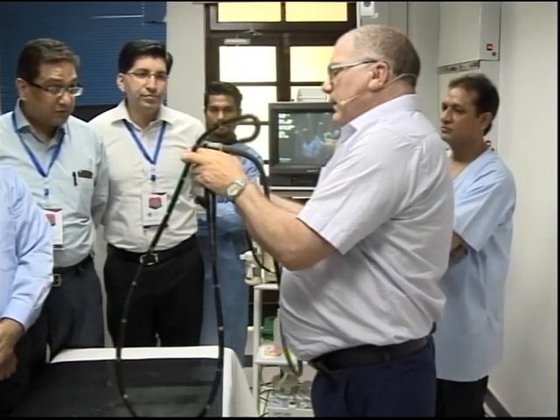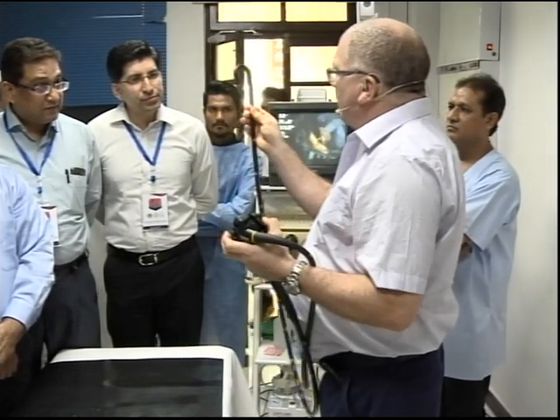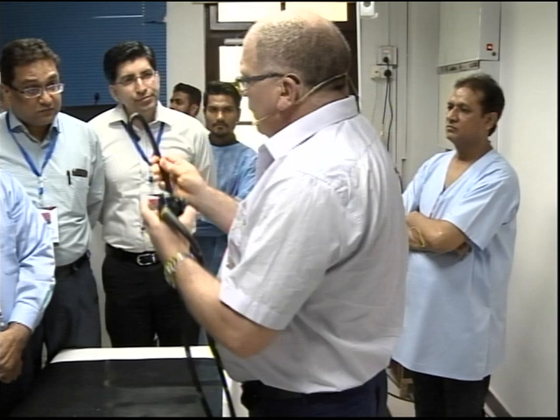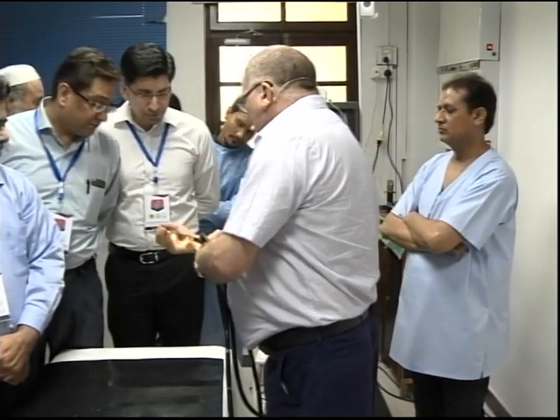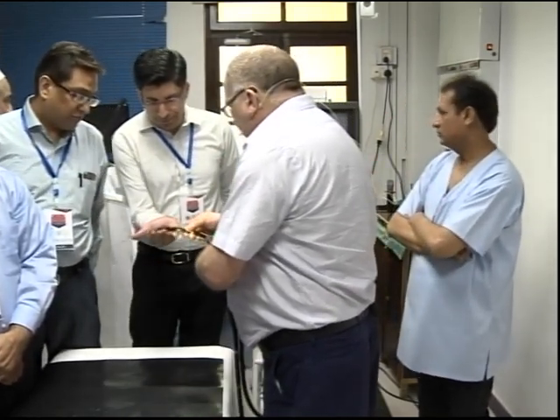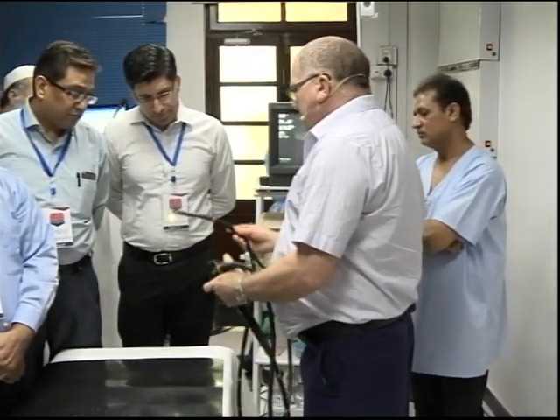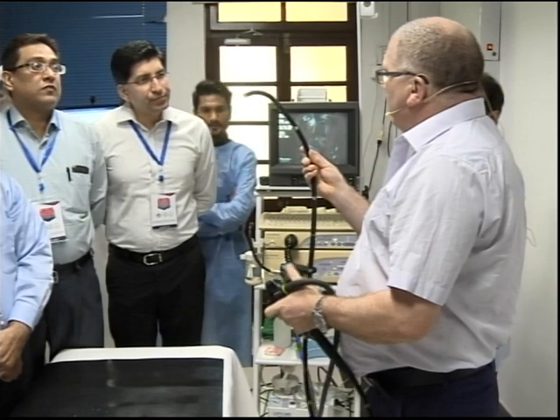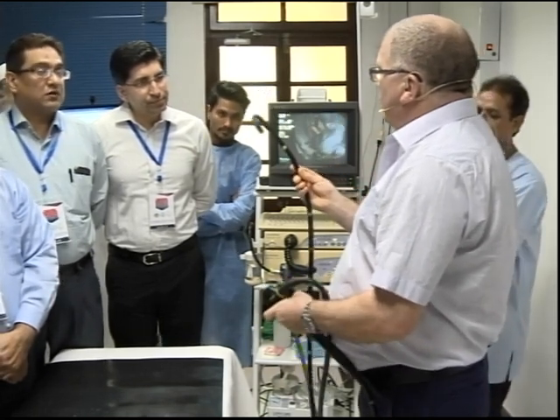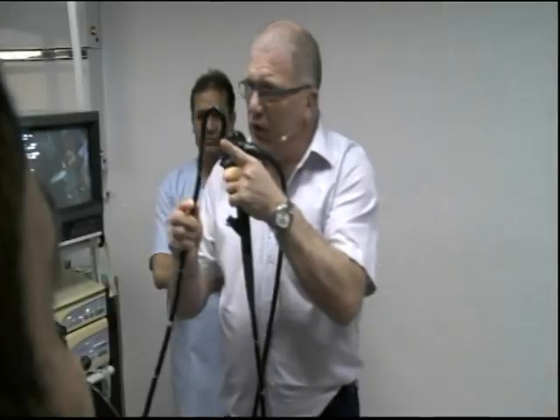Here's the scope. Here's the smaller wheel. Now what happens is, on a newer scope, can you see when the little wheel is actually occupying the space? Put your hand gently around the scope. Feel the gap? Now let go. Now put your hand around the scope. So drawing back the little wheel and then drawing back the larger wheel reduces the amount of space that it occupies. It increases the angulation, but it reduces how much space it takes up in the rectum.